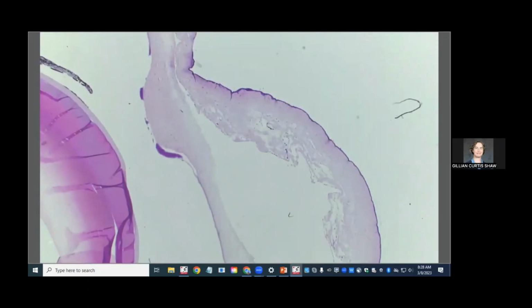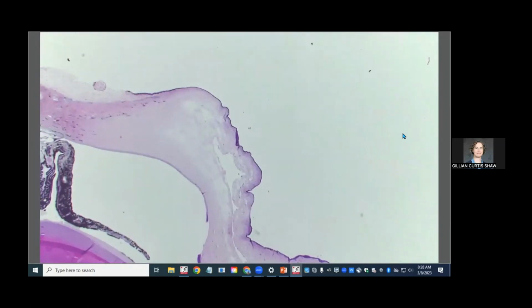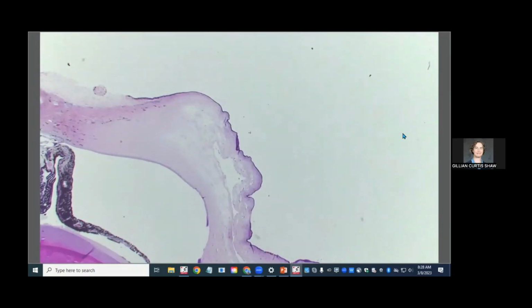And then even in the stroma surrounding those lacunae, we have a paler staining, pale eosinophilic stroma with separation of those stromal fibers. So this is what a very severe corneal edema looks like, and this is what we would also refer to as corneal hydrops. So often histologically, we can't be sure, we can't confirm corneal edema ourselves.